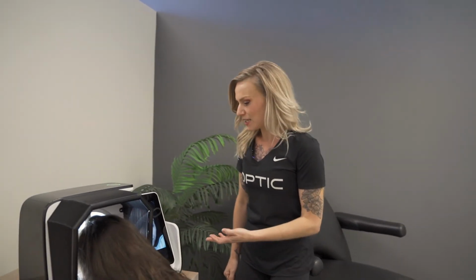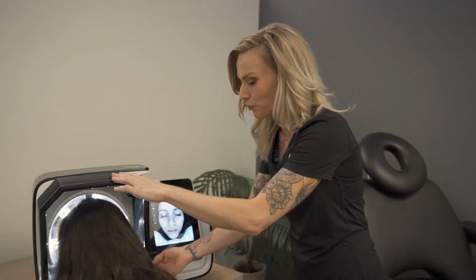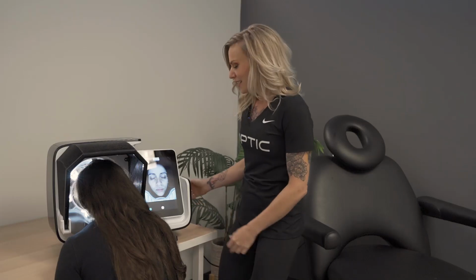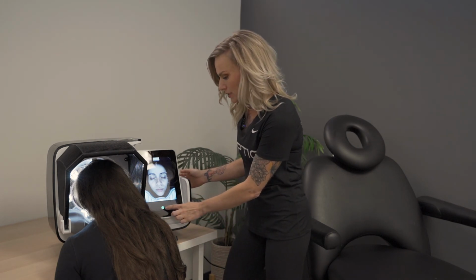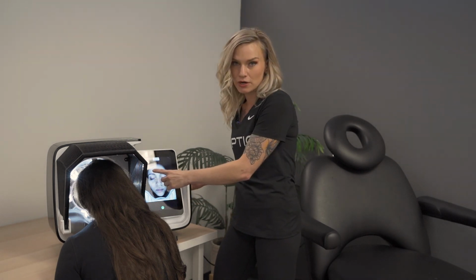Now that the patient's scan is all lined up with our guidelines, we want it to be a dark room. So we wanna make sure these are flipped up, and then we're gonna pull the hood down to block out any extra light. All right, now that our patient's skin is all lined up, please hold still for me for a second here. I'm gonna hit that button on the bottom one time. It's gonna take the series of 3 pictures. Our first picture is RGB.